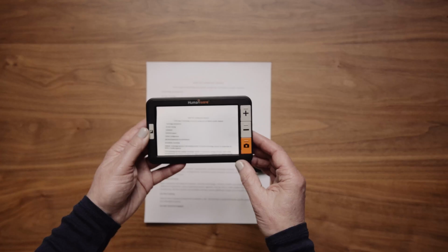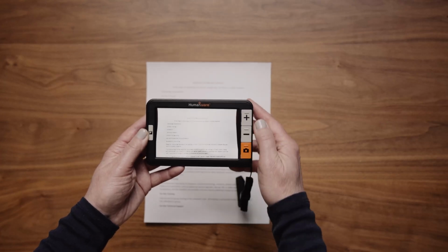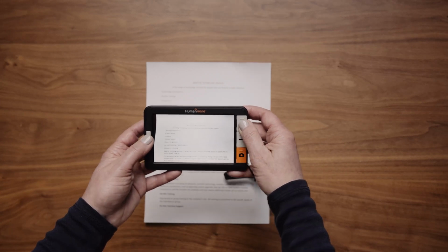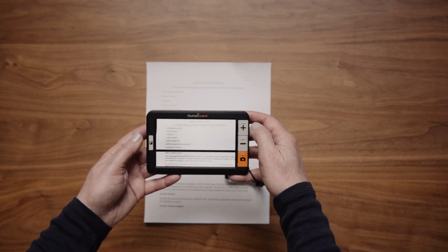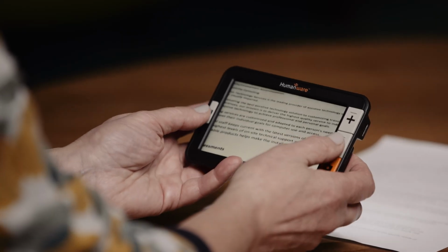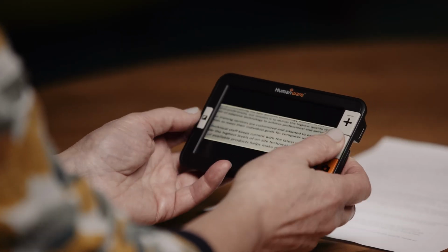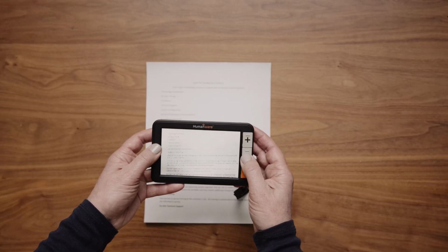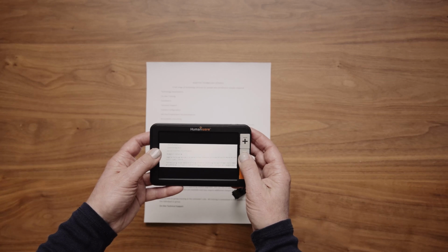1. Turn on or off the line feature by pressing the contrast and Zoom In plus buttons simultaneously. 2. Turn on or off the blinds feature by pressing the contrast and Zoom Out minus buttons simultaneously.